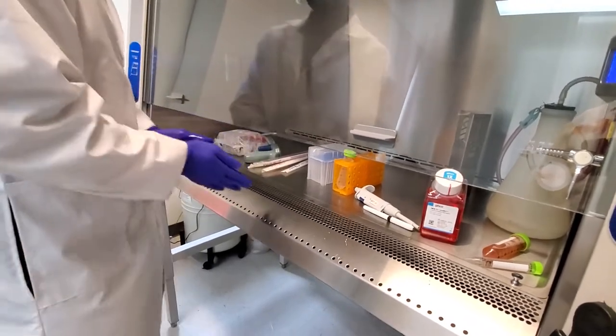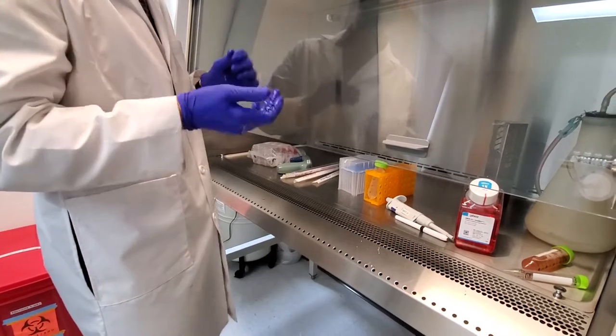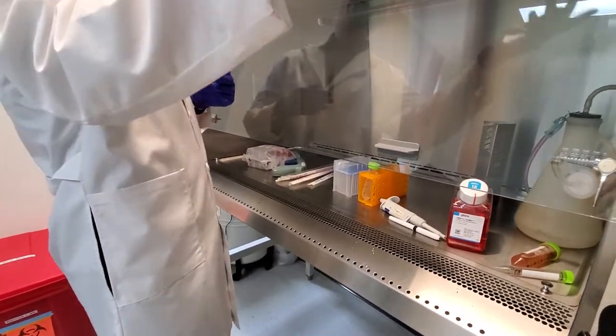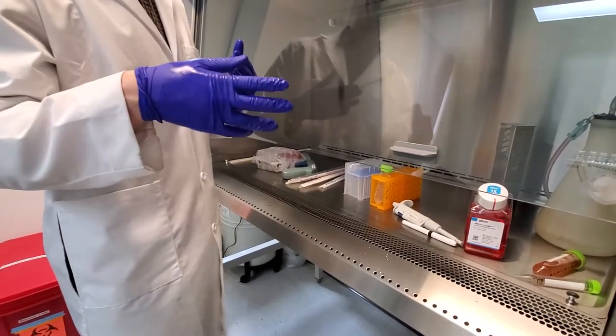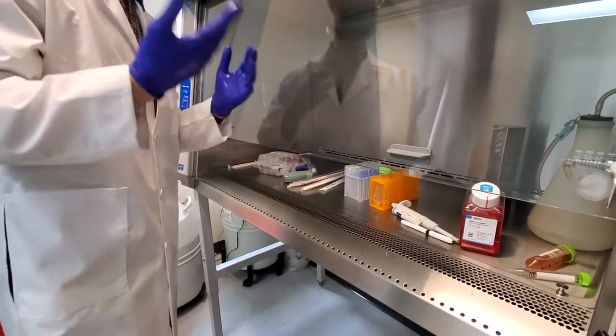Okay. So then, once you move into the tissue culture room, spray your gloves and smack them all over your hands. Normally we'd say change your gloves and put on a new pair, but you might be running low on gloves because of COVID.